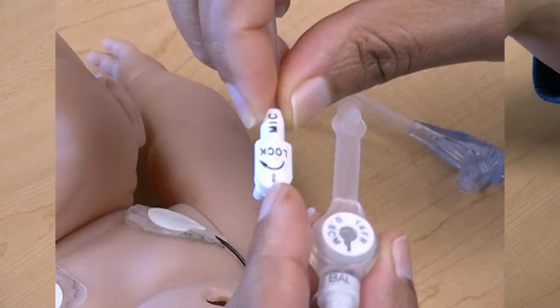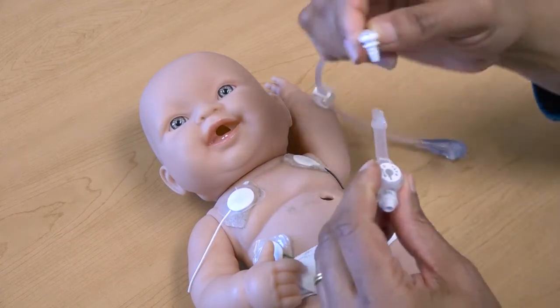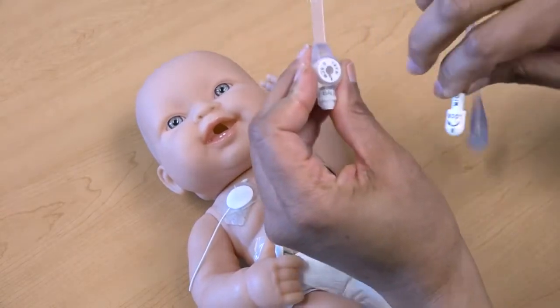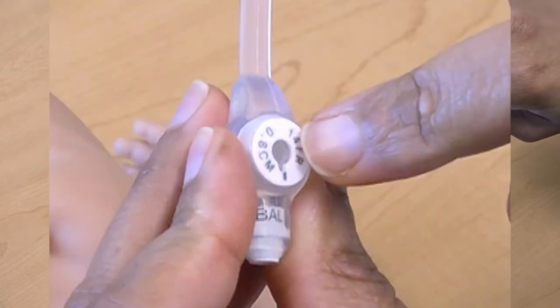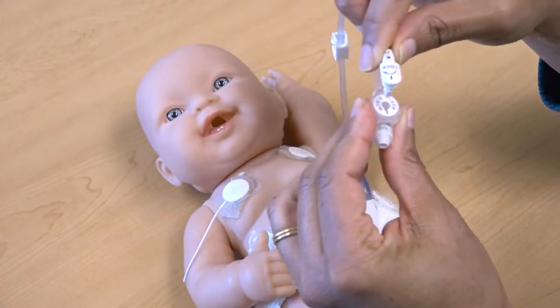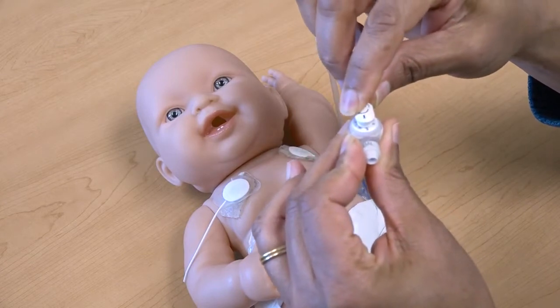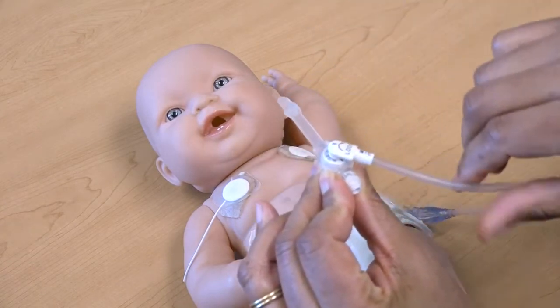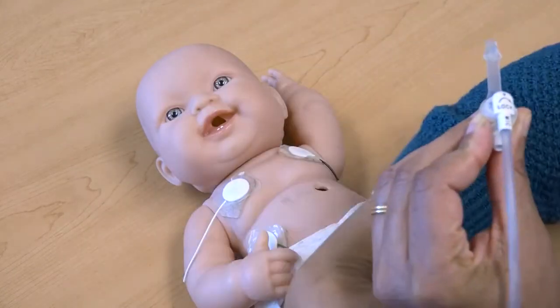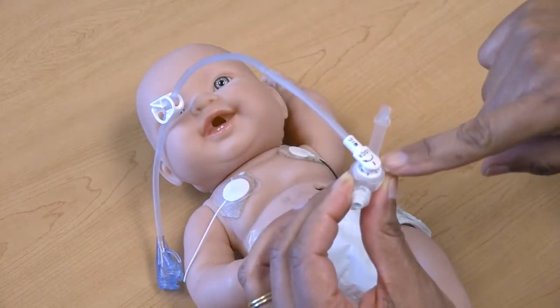There is a black line on this feeding port extension tubing. There is also a black line on the G-tube, and there is a little plastic notch, and there is an area on the G-tube for the plastic notch to fit into. So you're going to line those things up and push down, and then you're going to turn at least a quarter turn, but you can turn all the way. If you think about this as a clock, this being 12 o'clock, you can turn all the way to about the 10 to 11 o'clock position before you meet resistance.